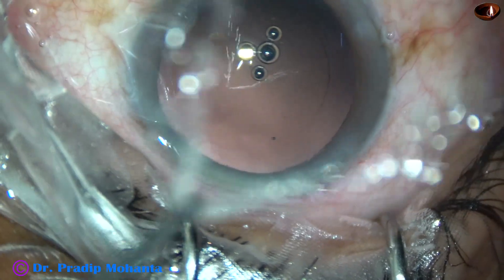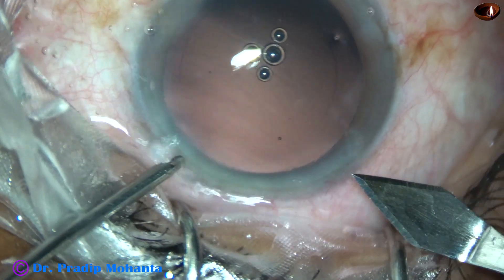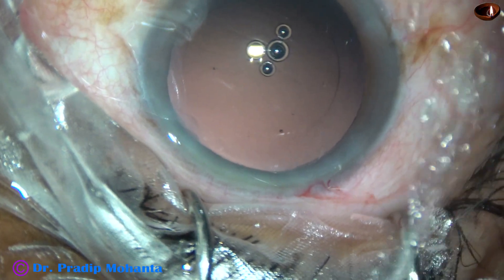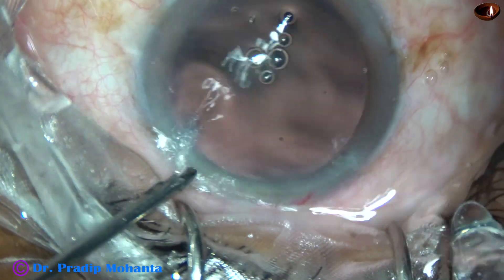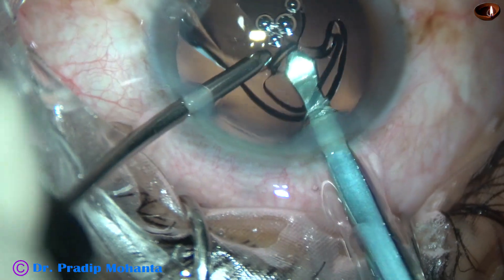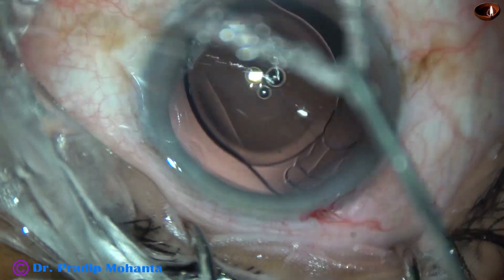And now is the time to implant an intraocular lens. Since I am going to use a B-cartridge, I am going to enlarge the main wound to about 3 mm. Because sometimes, if we try wound-assisted delivery with a B-cartridge, the lens may get stuck at the wound. So, it is better to enlarge the main wound just a little bit.